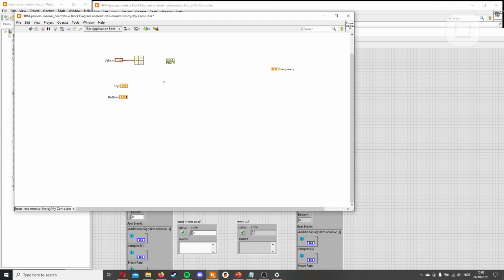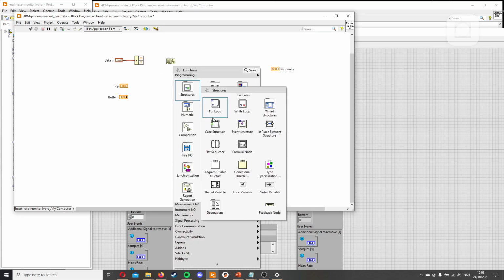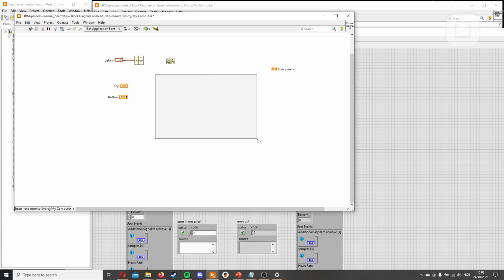What we're really measuring is peaks, but we want the peaks after they reach a certain bottom value. We need something that goes through every value, so we'll need some sort of loop which goes through every value of y and checks wherever it crosses the top value after it has reached the bottom value. So let's wire these up.